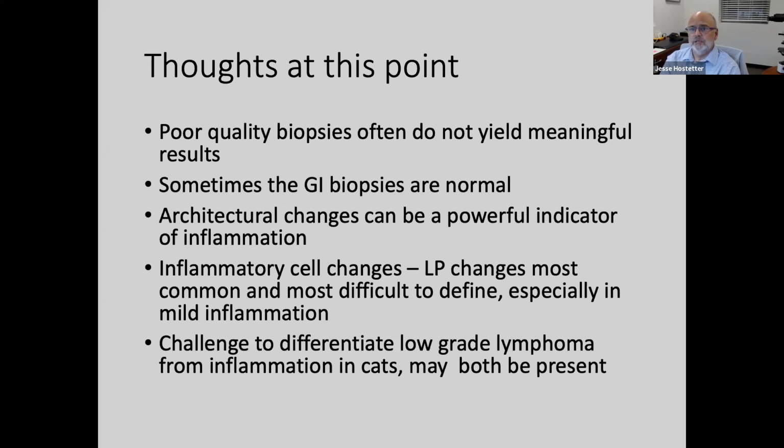And I'm going to go for another 15 minutes. We can talk a little bit about the low-grade lymphomas and how they're a little bit more difficult to differentiate from inflammation. Got some questions here. I'm hoping I can come back to these in a few minutes when we talk a little bit about neoplastic changes.